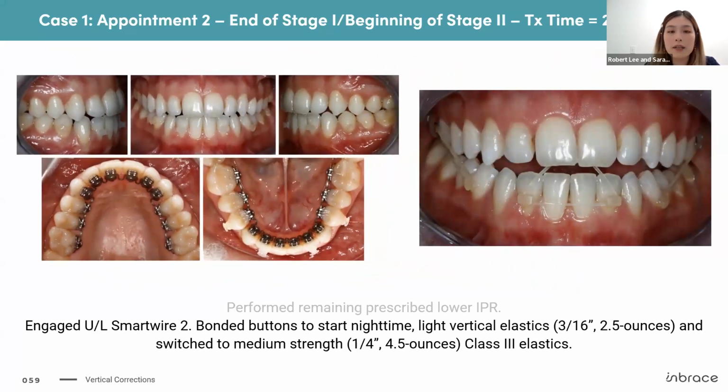And here you can see the pattern that's going on, the class 3s on the side and the anterior vertical elastic.